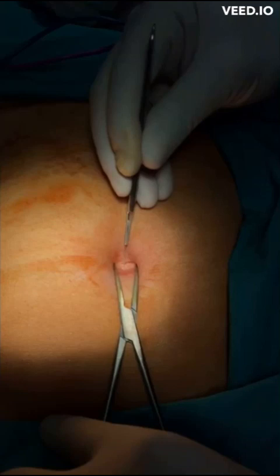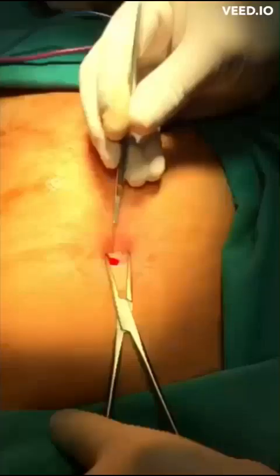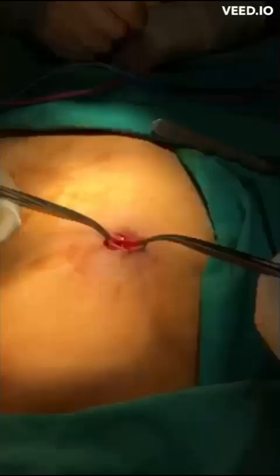In this video we'll describe our novel laparoscopic abdominal entry technique, which is named the Teras Lift Up Technique. It is an anatomical landmark-based and easy-to-handle technique.